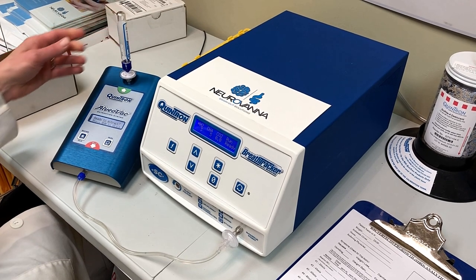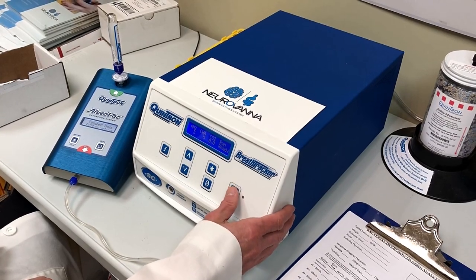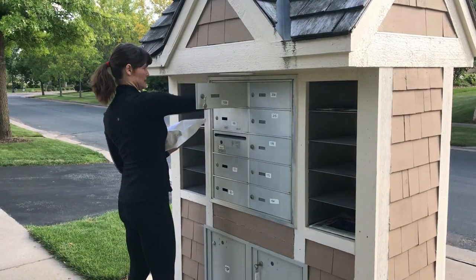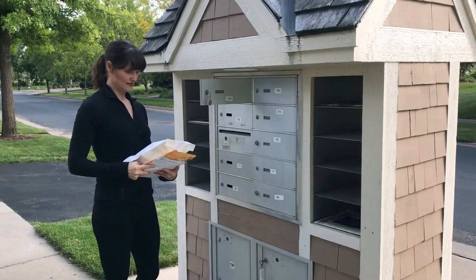Welcome to Neurovana, where we test breath samples for detection of small intestinal bacterial overgrowth, commonly referred to as SIBO. The actual breath test collection is done with an easy-to-use at-home collection kit. This video will walk you through the collection and shipping process.